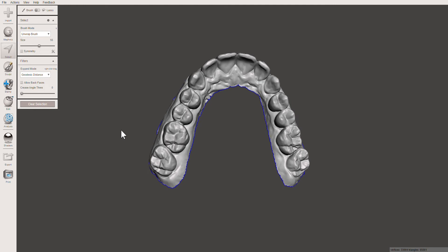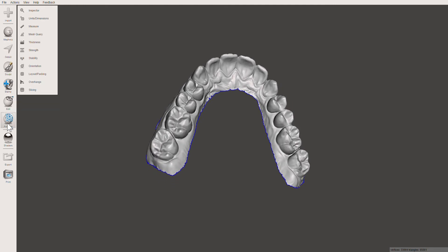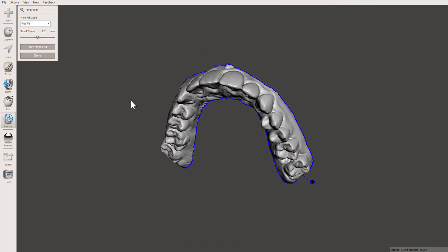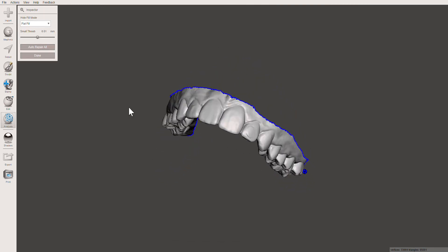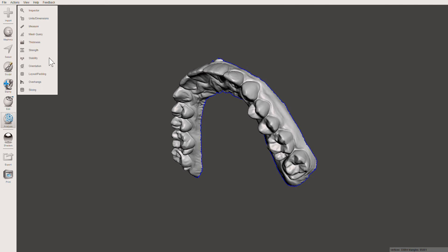I've got my edges all cleaned, so I'm going to check for holes one more time using Analysis and Inspector. You can see we don't have any other holes except for just this one boundary — don't click on it, just press Done. Now we can extrude the model.